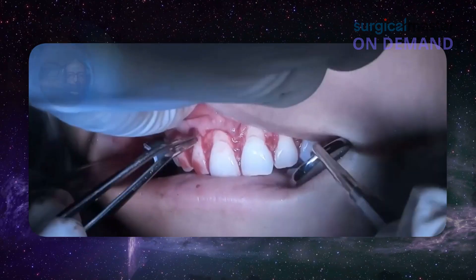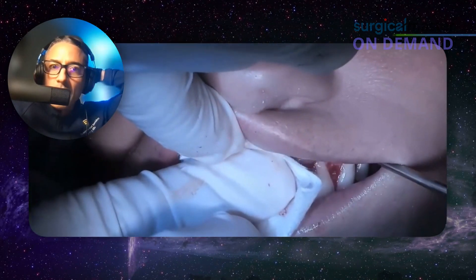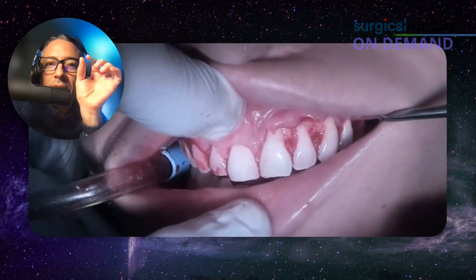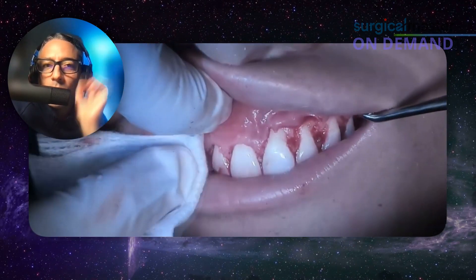So what I decided is, first of all, not to worry about the tear. Suture the flap in the papilla and see how the tear aligns. If I suture in a certain way and the tear stays open, not a good thing. But if it aligns in the suturing, I can then glue it.